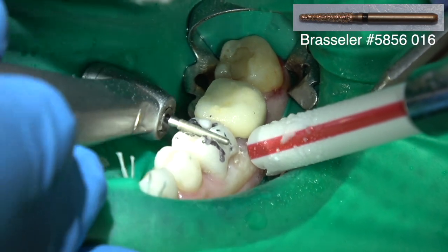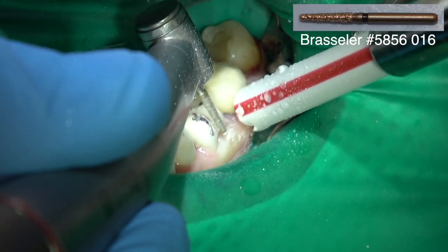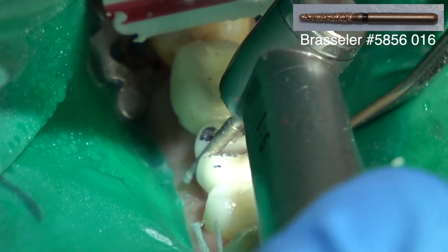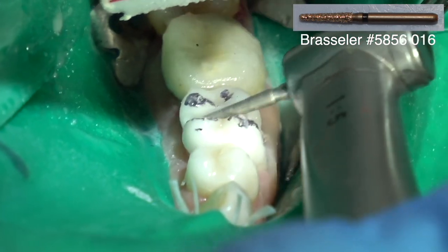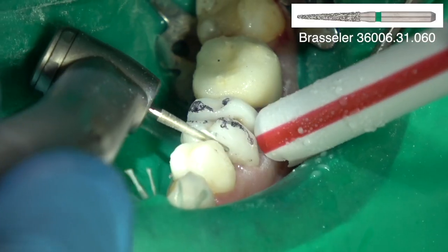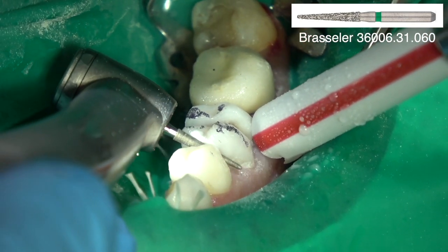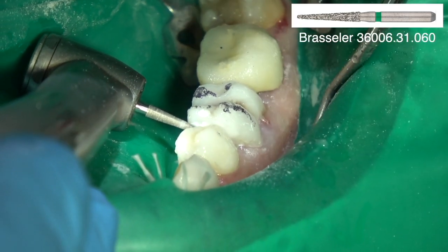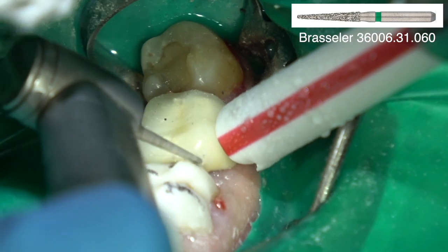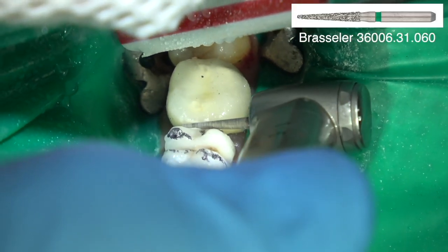So I'm sectioning this zirconium crown — I hate to do it, it's like cutting through a shot put or a piece of flint, it's so hard. This is just a coarse barrel diamond with light pressure. You don't want to press hard — just light pressure and I'm cutting all the way through the crown. Now I'm creating a space proximally with a thinner coarse barrel diamond, creating a space between the tooth to be extracted and the adjacent teeth. Zirconium is really hard on burs, but don't press hard. Lots of water.